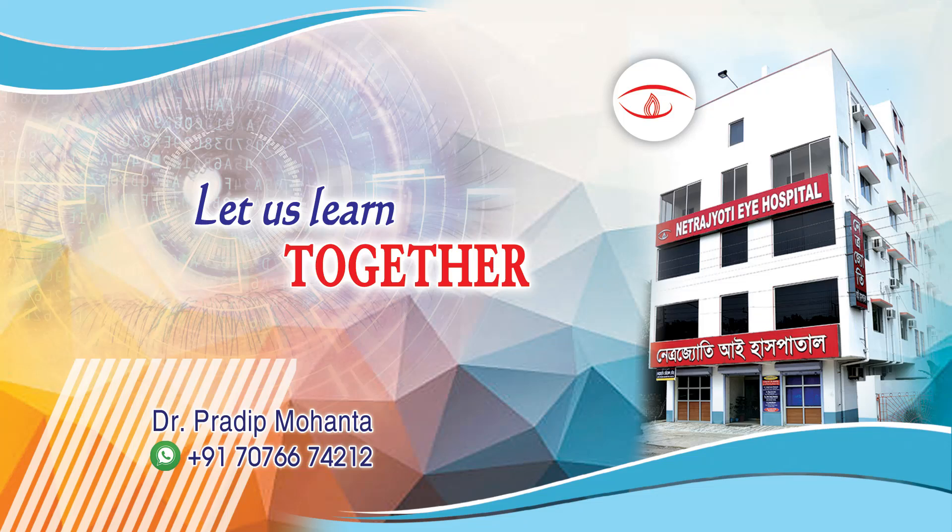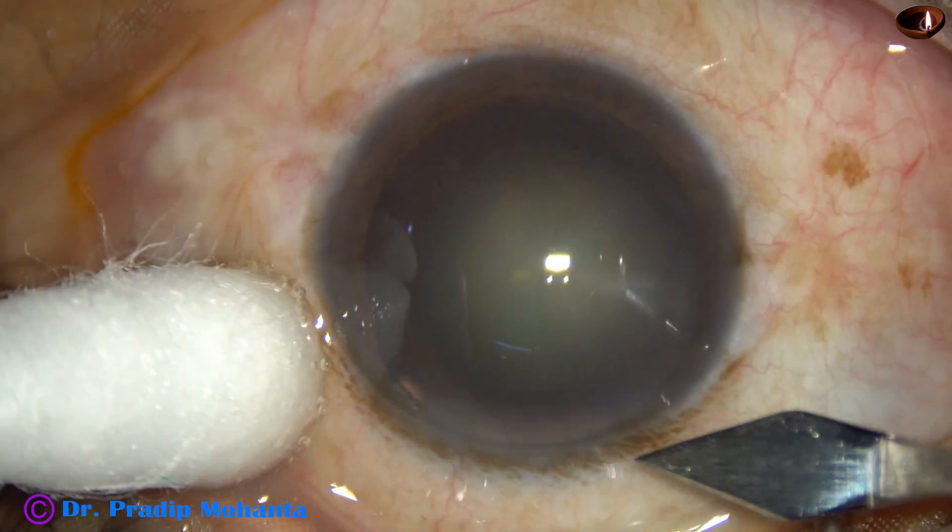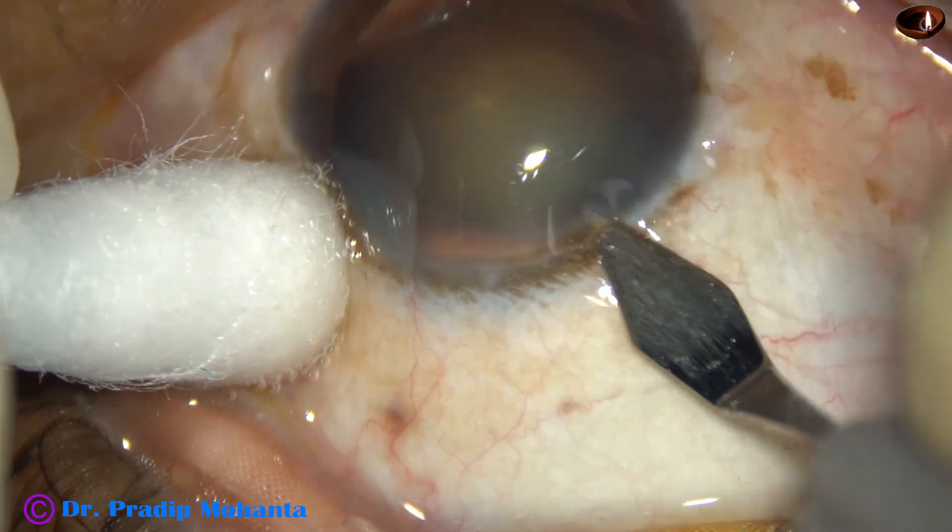Friends, welcome to my workplace at Rana Ghat, West Bengal, India. This is a cataract with grade 3 nuclear sclerosis. Let us observe this surgery.